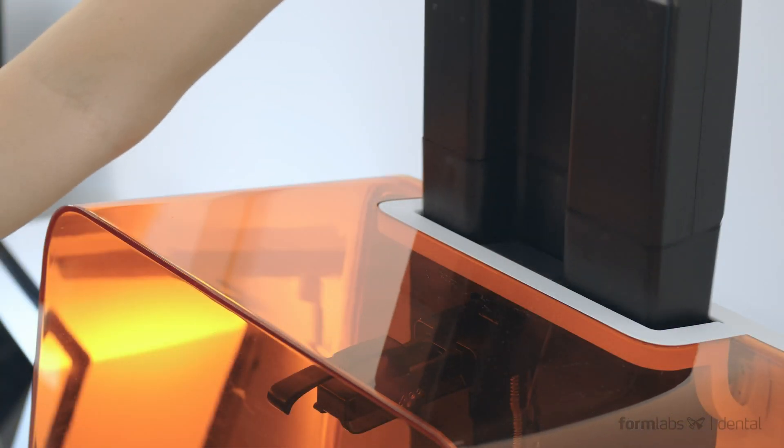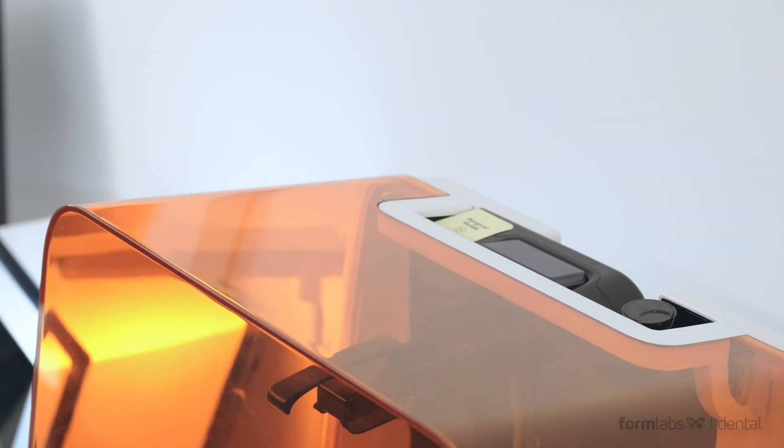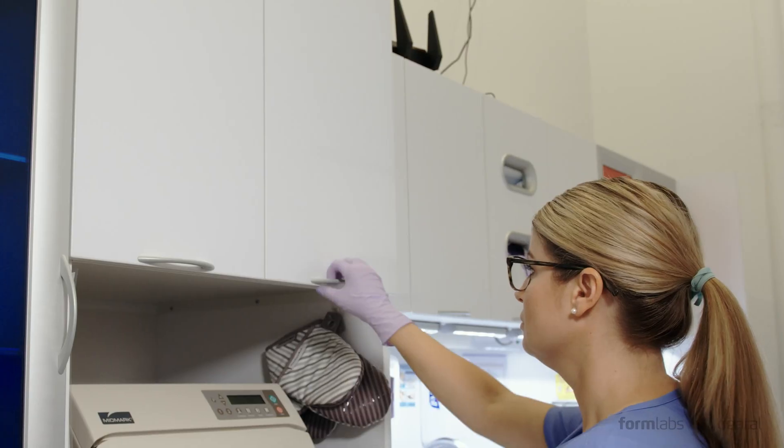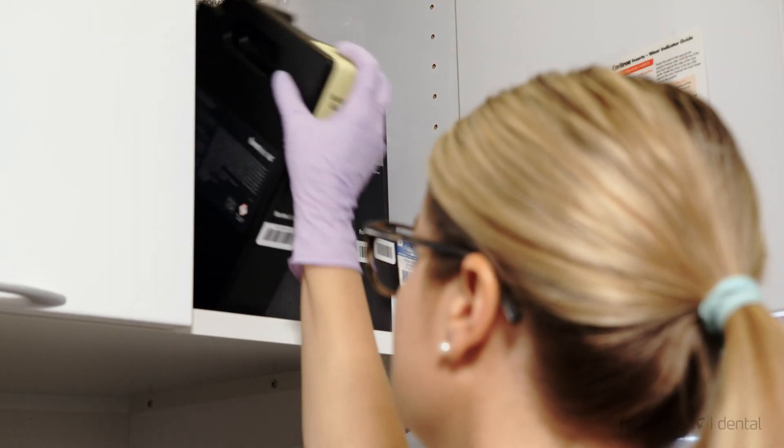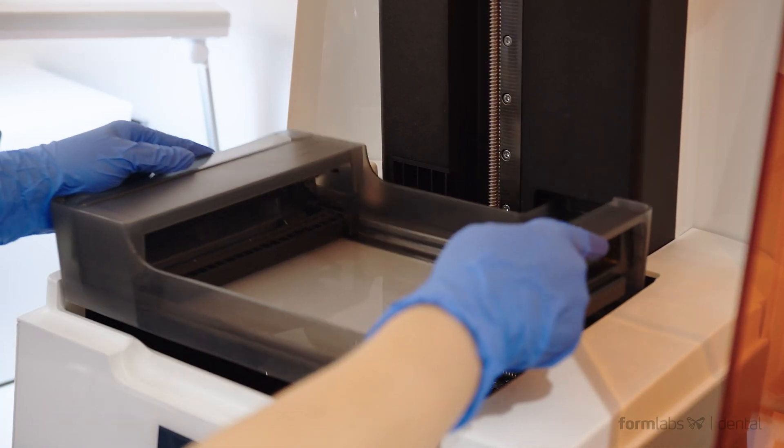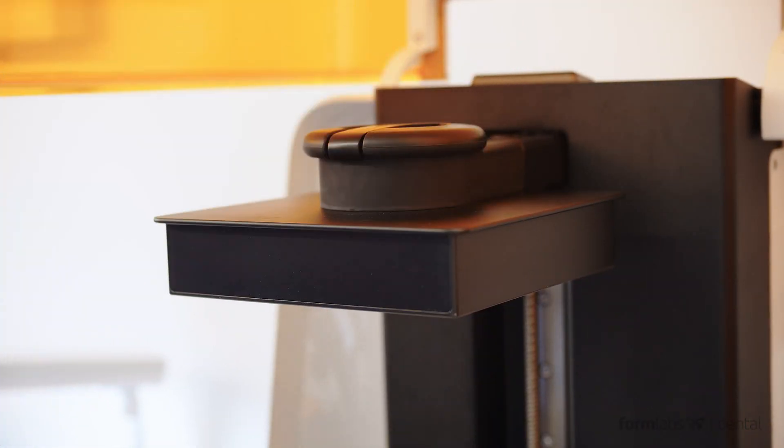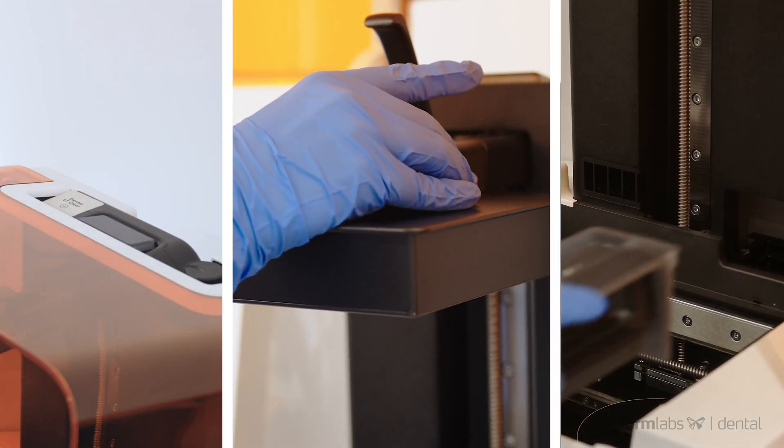The Form 3B's mess-free, easy-to-use resin cartridge system, compatible with existing Form 2 resin cartridges, and the easily replaceable resin tank and build plate make changing materials and getting the printer ready to print a simple three-step process.